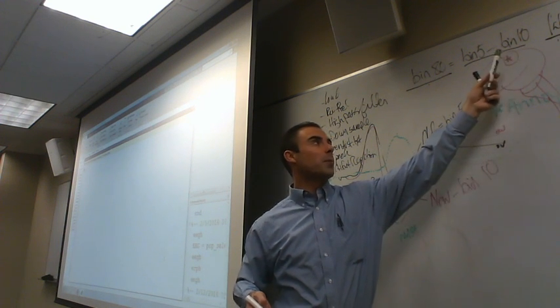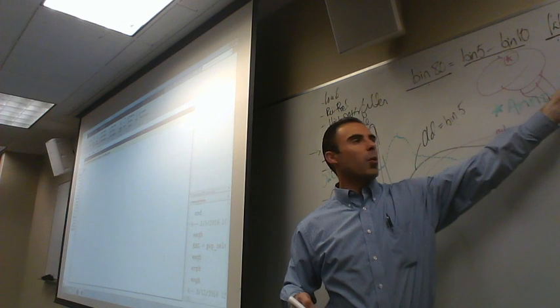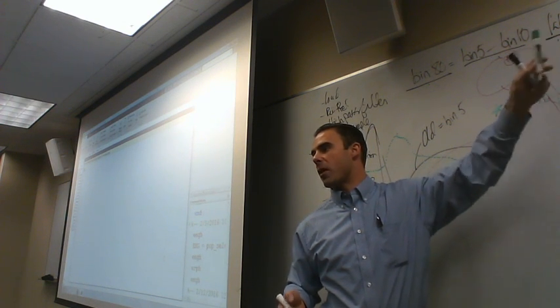So it's impossible to work backwards and say, we have this, can we figure out where it came from subcortically? It's just not mathematically possible.